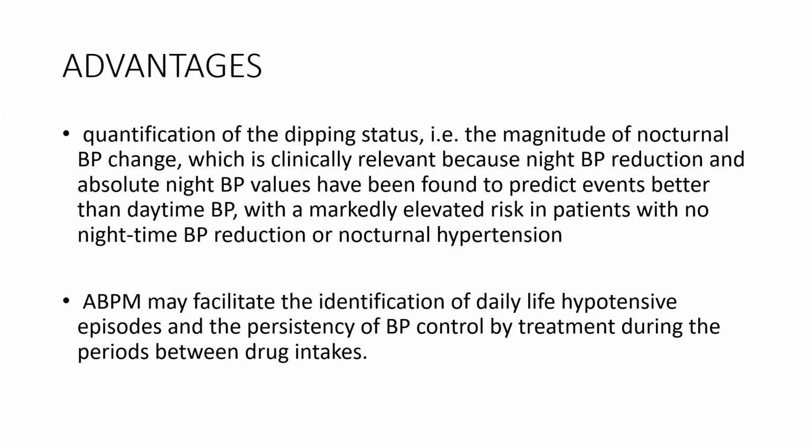It can quantify the magnitude of risk in patients with reduced dipping or nocturnal hypertension. So it's able to assess nocturnal hypertension and dipping status, which is an advantage it has over home blood pressure and office blood pressure measurements.